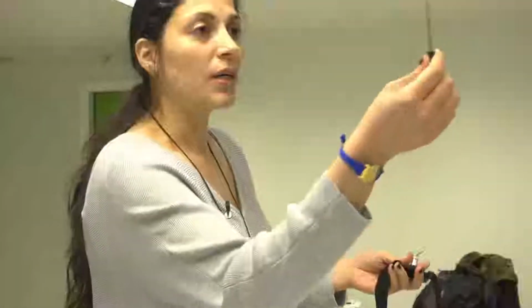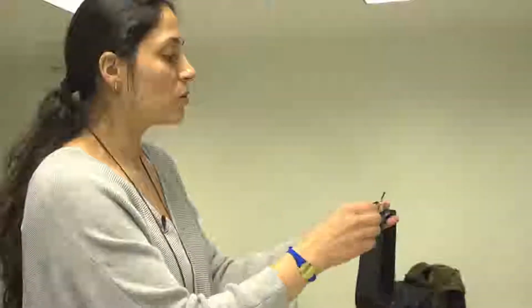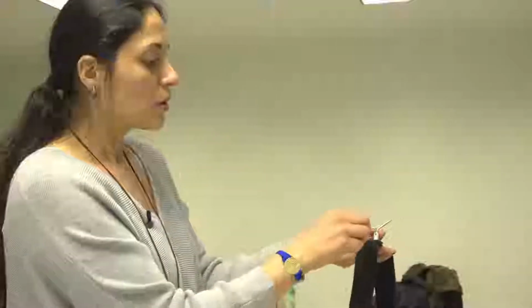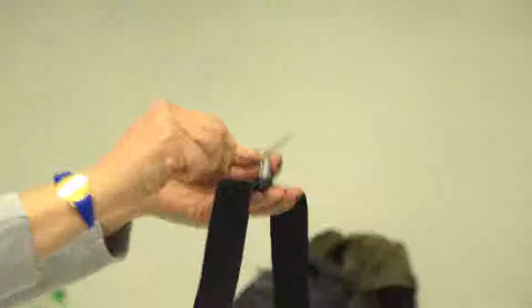You have these different screws, and what you want to do is position this thing here and just inside. This is to tighten the sensor. Probably there should be another one here and I don't see it, and then here.